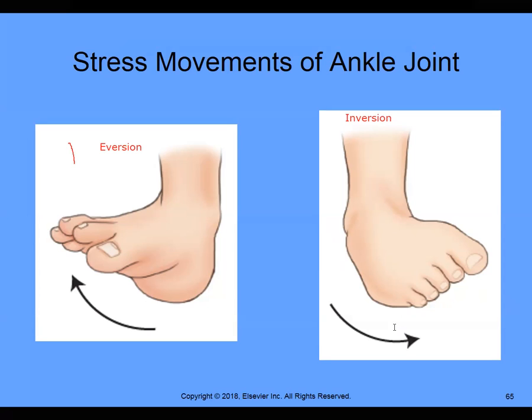Most of the time our foot would go in this way, causing that ligament to be swollen because we've overextended that ligament. But we do have special views that we do for that particular ligament. And so we're going to either evert the foot, the ankle, or we're going to do an inversion of the ankle.